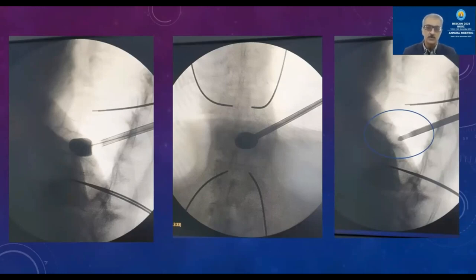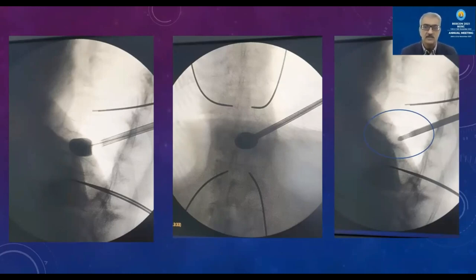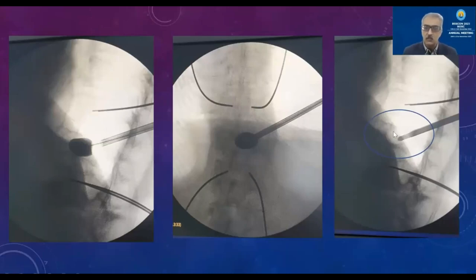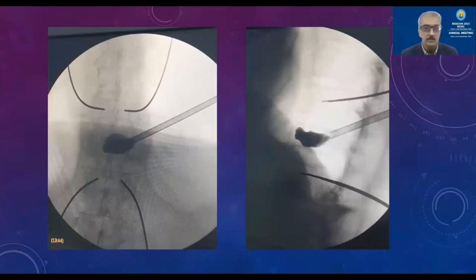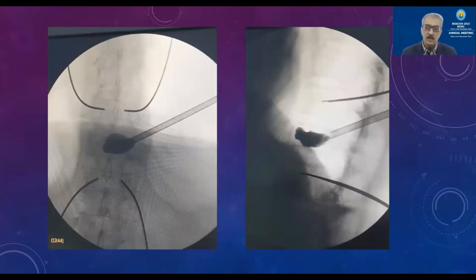Once the balloon is inflated and in good position, start mixing the cement. Once the cement is about three to five minutes old — that is, becoming toothpaste-like in consistency — remove the balloon. This leaves a void, and into this void you fill the cement with the cement injector, filling until you reach the posterior one-third of the body. Do not remove the injector or the working cannula, as there can be leakage. Leave it for 15 to 20 minutes until the cement hardens, rotating the injector and cannula so they do not set into the vertebral cement.